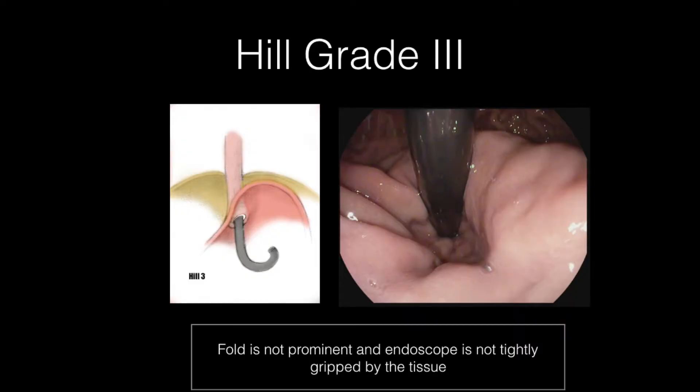In comparison to grade 1 and 2 valves, a grade 3 gastroesophageal valve has no prominent fold at the entrance of the esophagus into the stomach and the endoscope is not tightly gripped by the tissues. The valve stays open under full insufflation during the examination.